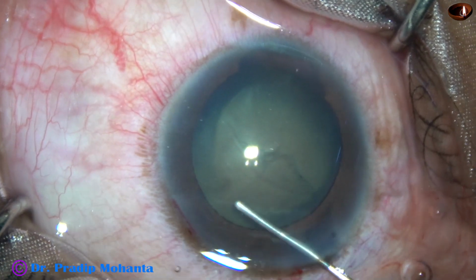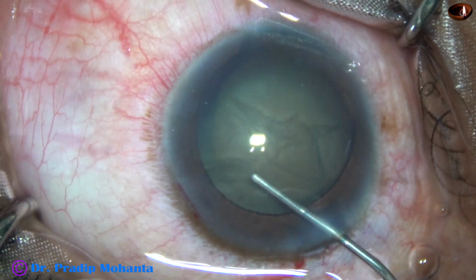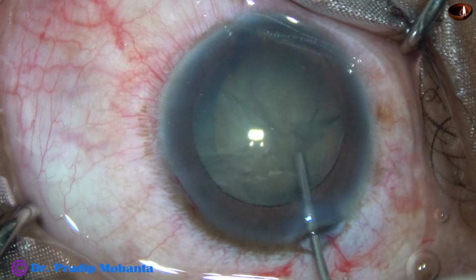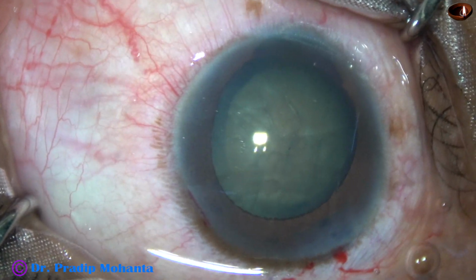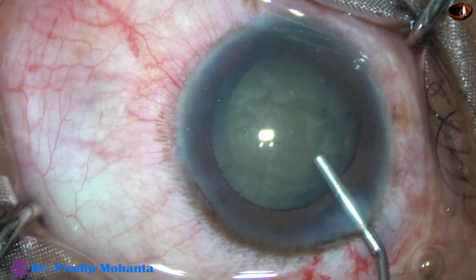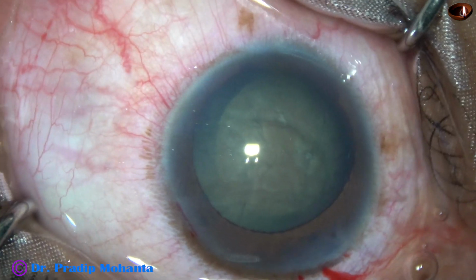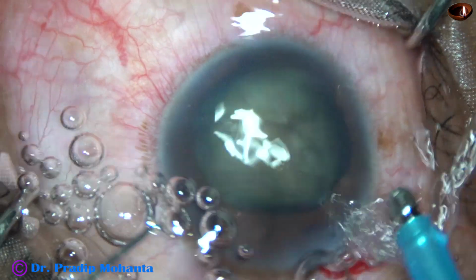Now hydrodissection is done. The central part of this nucleus is quite hard. The peripheral part is not so hard. Visco is injected, and now I introduce the Phaco needle into the anterior chamber with its bevel down.